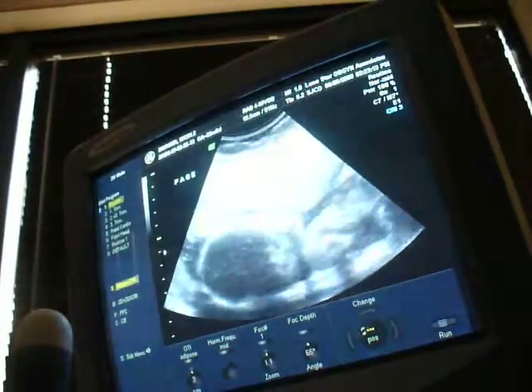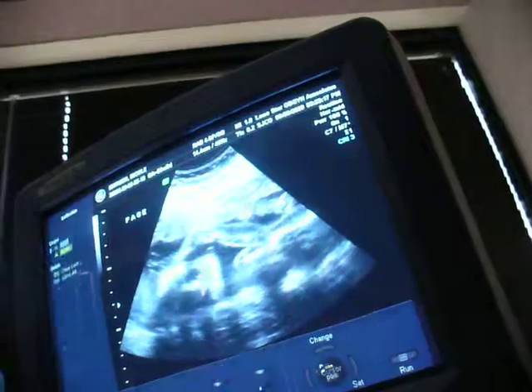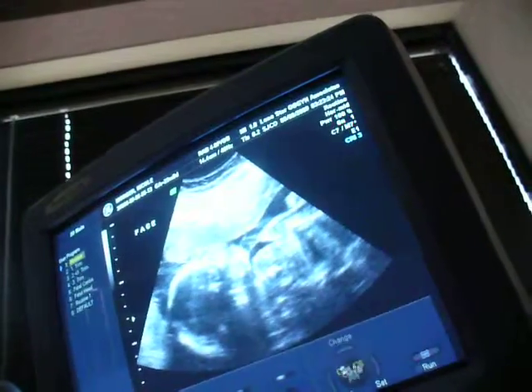Okay, now let's kind of come over this way and try to get a profile. Sorry, you all right? You can see that foot kicked up here. You see that little foot? Right up there, here's a hand. Here's a little side view of the head. You see how I just moved its mouth?